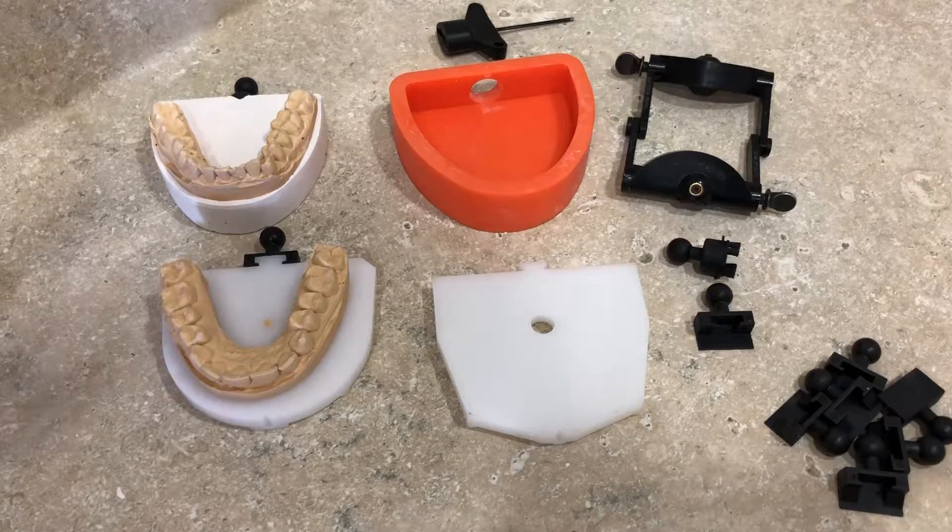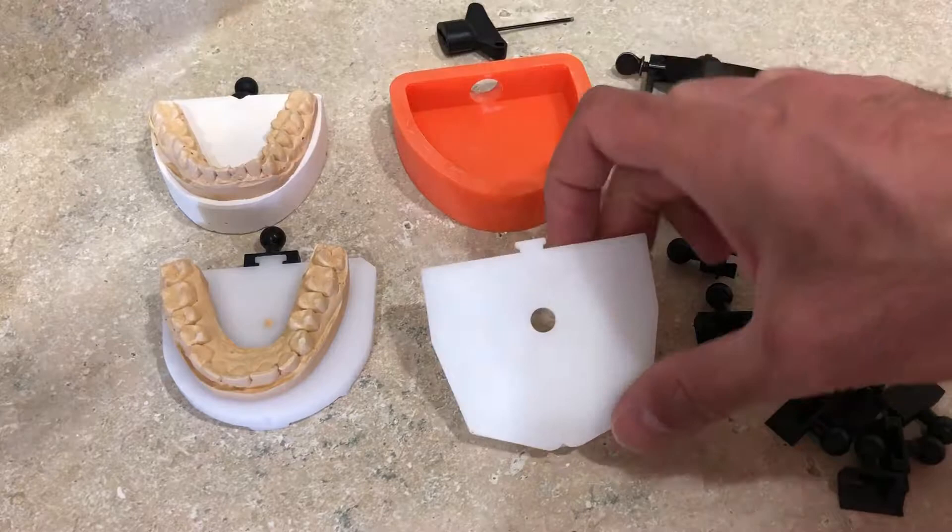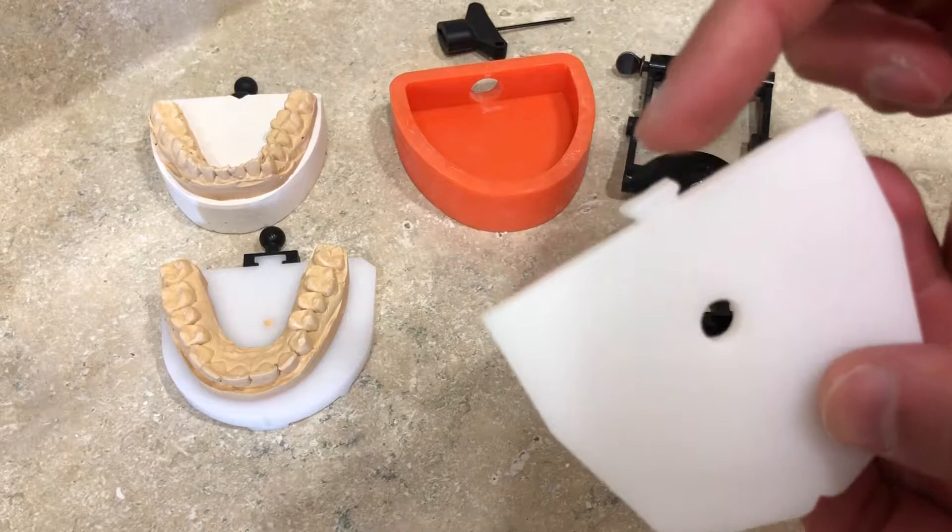Hi guys, this is take three of the twister articulator. This time I'm going to show you how to use the twister articulator with the Amman Gearbach or Zizer system. As you all know, Zizer or Amman Gearbach have those plates and they have that hook kind of shape right on the back of their plates.